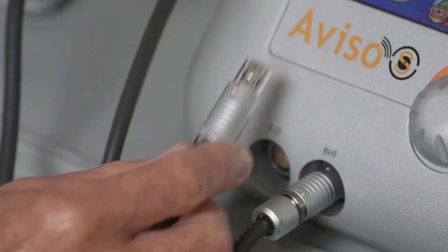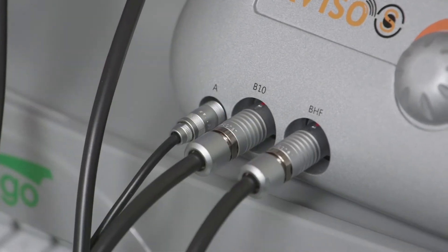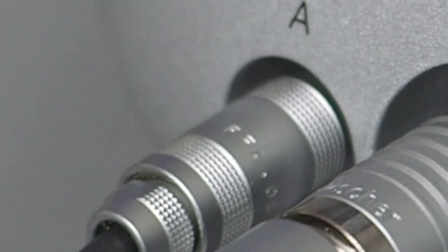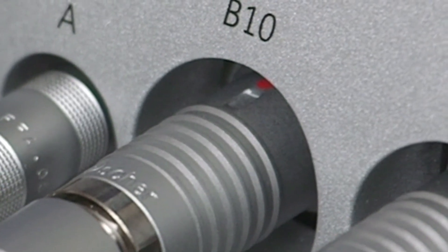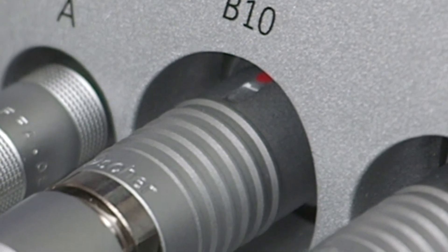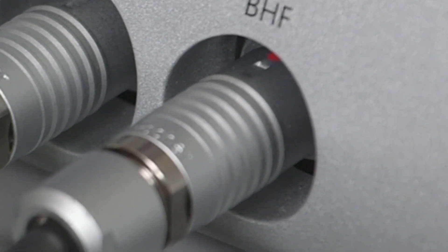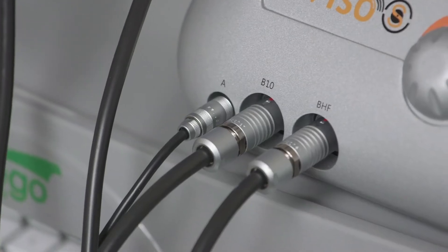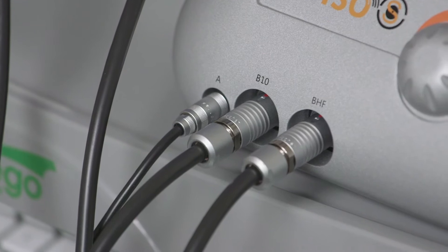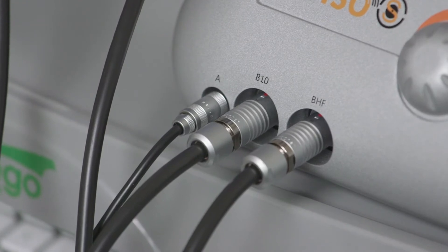Three probe connections are located on the front of the unit: one for an A-scan probe, one for a 10 MHz B-scan probe, and a third for the high-frequency B-scan probes. Red dots on the probe connectors and on the Aviso-S module help guide proper insertion.